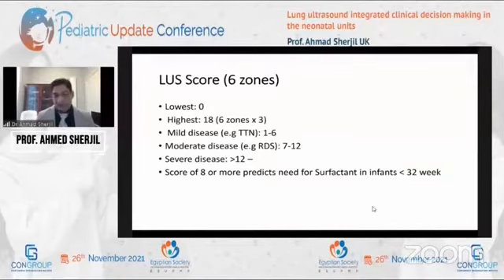Having said all this, it's really important. The most important thing about point of care scan is integration into the clinical situation. So what guides you, what leads the whole situation is your clinical decision, and the ultrasound has to go along with what you're perceiving and what you understand. This gives you evidence. It does not deny, and it shouldn't be taken as a final word. So the clinical assessment matters here. So it's not like you have a score of 8 and go for surfactant. It's something that we're going to see in my presentation just now.